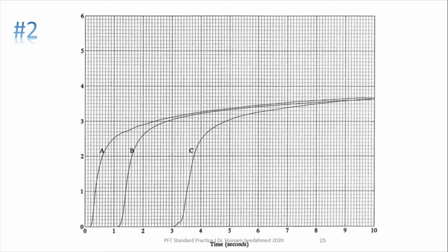Yes, they are not acceptable. So why are they not acceptable? Okay, Dr. Mahmoud. Yes, they are not acceptable. Yes, extrapolated volume in which one? Yes, there is extrapolation in curve C, as you can see here. Now, what is the other reason? There is something else that is very clear.